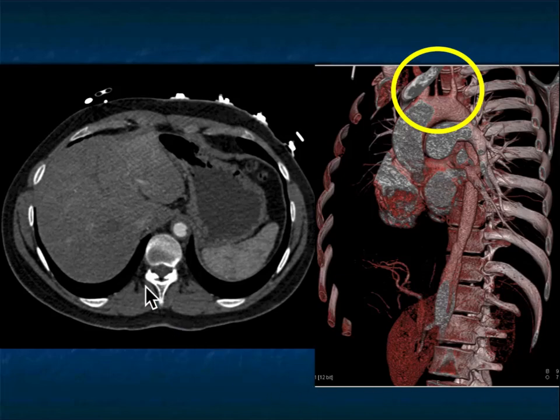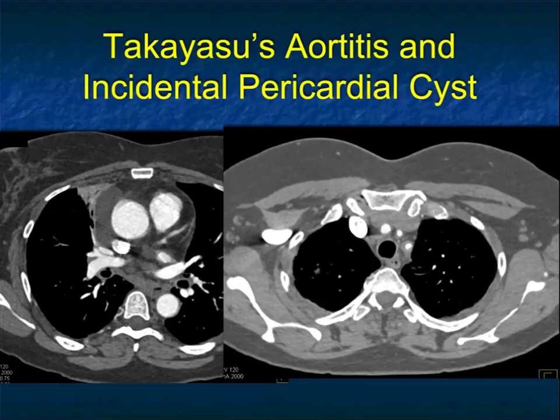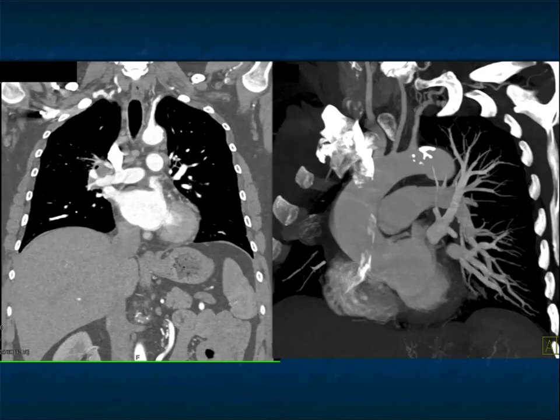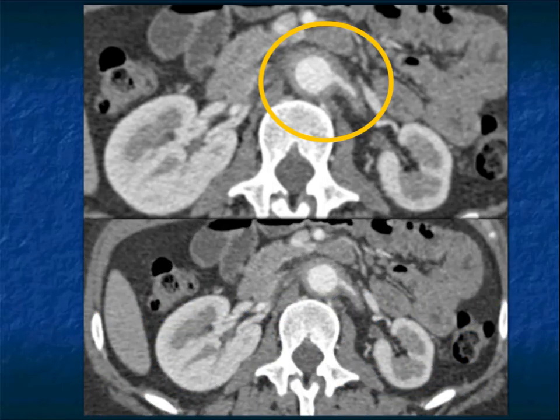In the same patient, looking at the aorta at the level of the diaphragm, you see the thickening and the branch vessels off the arch are narrowed. This inflammatory process around the vessel causes narrowing of the lumen and thickening of the vessel wall. Another example shows a patient with an incidental pericardial cyst but also the changes of Takayasu's — marked thickening of the left subclavian artery, the key vessel. On the oblique MIP image you can see the irregularity, areas of narrowing, and irregularity. The abdominal aorta shows thickening with involvement of both renal arteries — lumen narrowed and soft tissue thickening increasing around the vessel.